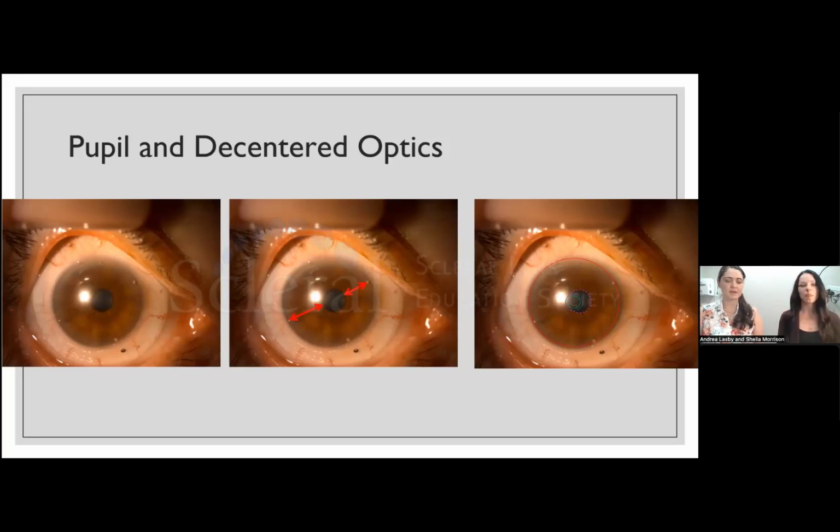Not super common, but I do use it, especially when it comes to multifocals, because we do have that little bit of decentration that works really well with some multifocals, and some multifocal manufacturers come automatically with that, as long as you have a really stable fit. So I'm finding better results with my multifocals when I decenter the optics, but you can do it for other reasons too, even single vision, for example.